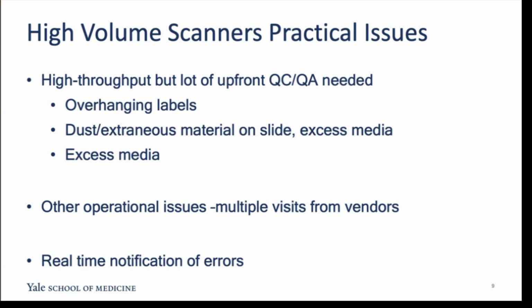We found that these scanners, and perhaps you have one of these and you have had similar issues, though the scanners are fast and they deliver very good images, they're quite finicky and they require a lot of upfront QC/QA. The GT450 throws a bunch of errors. Some of them are because it doesn't find maybe tissue in a slide and it just scans the entire slide. So those kind of errors have less impact on workflow.